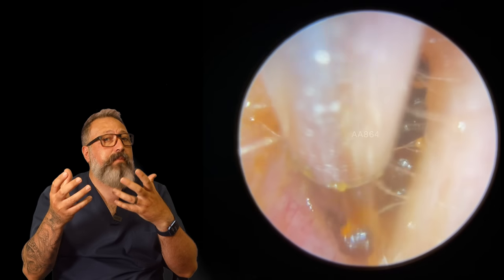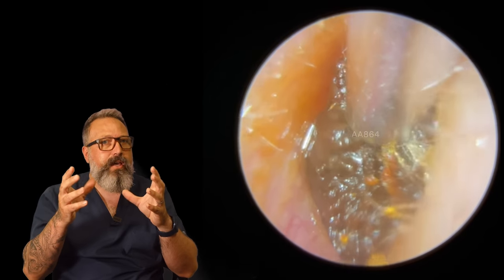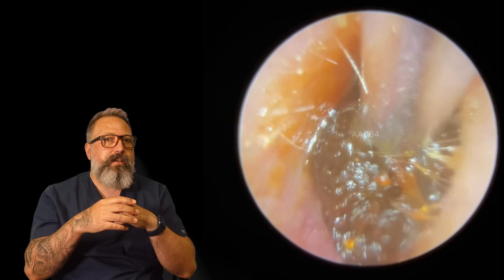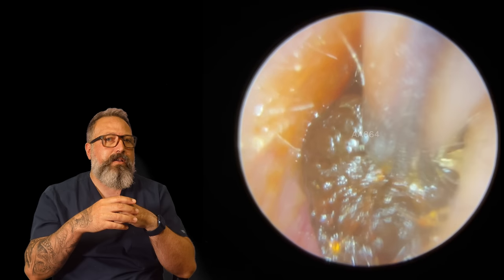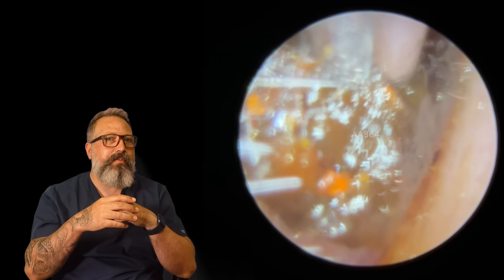That's a perfect example of when to use some irrigation — it clears those canal walls off really, really easily. But you can see here it's coming away very, very well. Let's give this a little bit more of a suction grip, a bit of a wiggle, and out this is starting to come. Look at that plug working its way out.